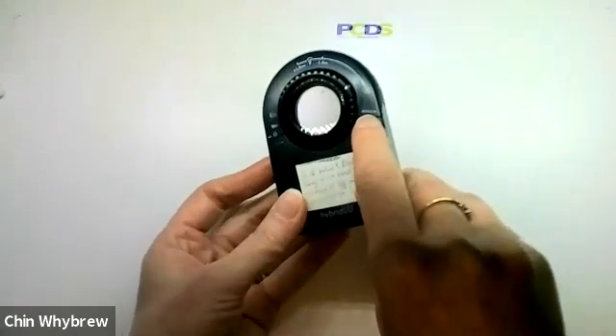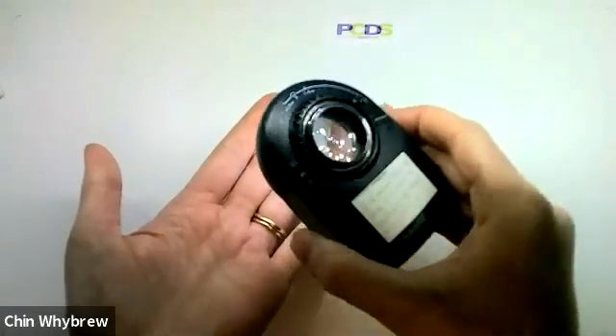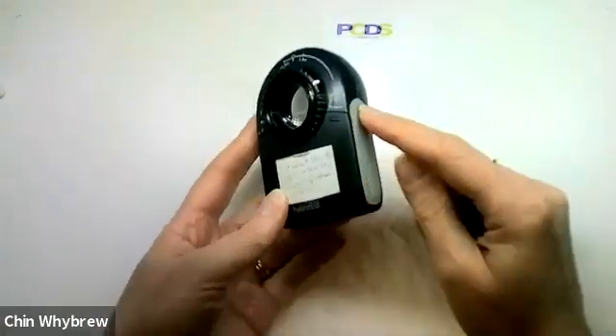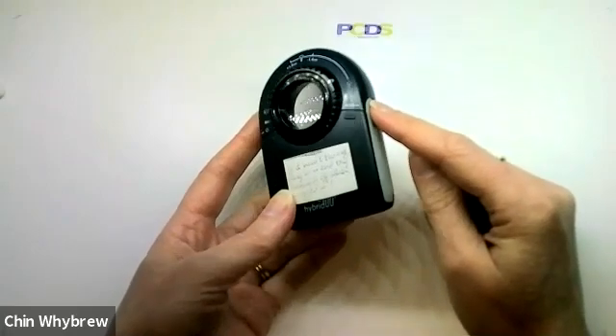And then on this side, there's a button that's labelled mode, and that switches it between polarised and non-polarised mode. This does not have a light to tell you whether you're in polarised or non-polarised.